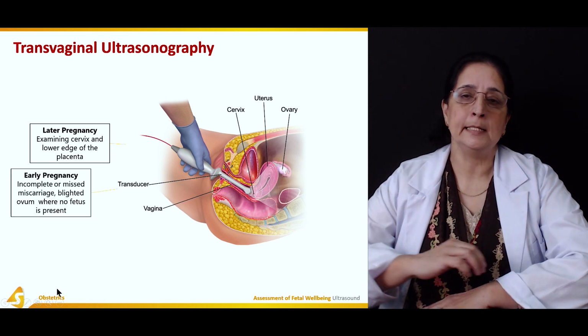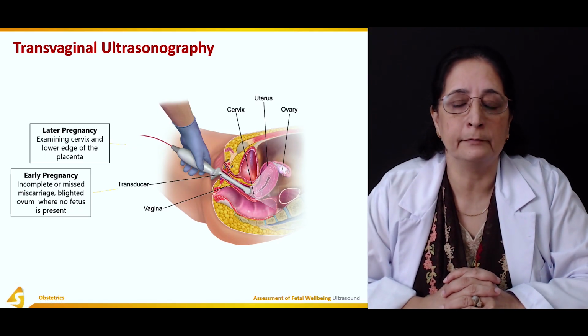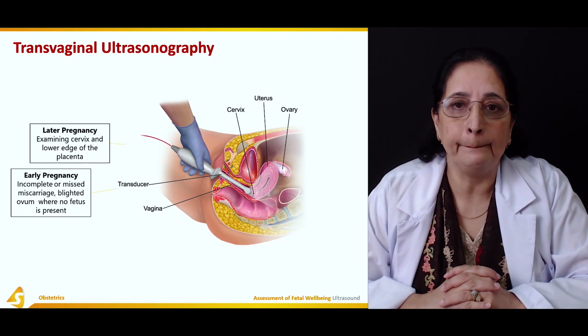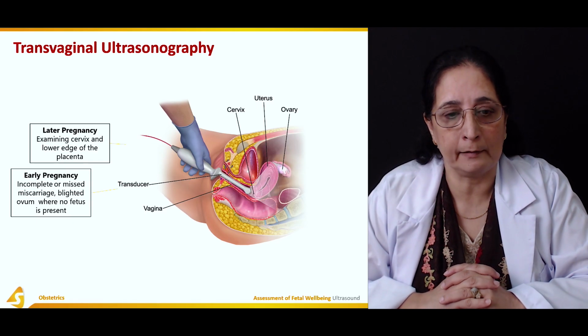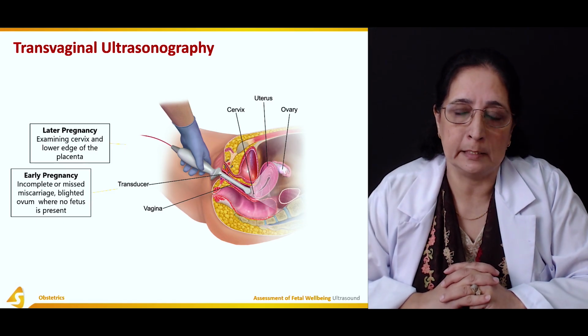In early pregnancy, we need to perform transvaginal ultrasonography if there is an incomplete or missed miscarriage, or if there is a blighted ovum where no fetus is present.